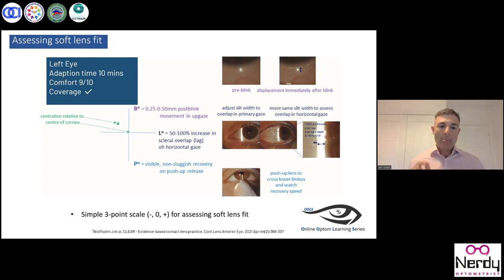What was interesting was, if you were to take any of these measurements in isolation, they're not very good at predicting how well a lens might be successful. If anything, push-ups seem more relevant, but actually collectively, they do form that interpretation for us. Obviously, an ill-fitting lens won't be comfortable necessarily.